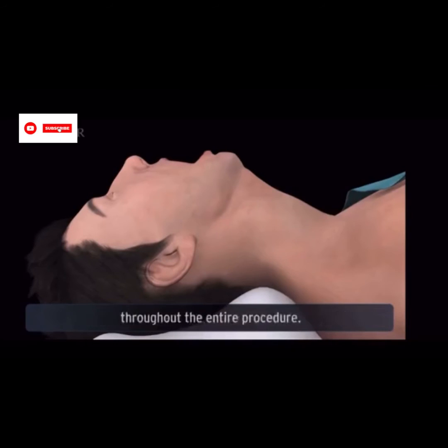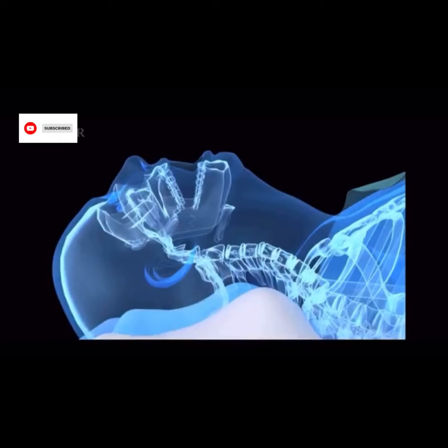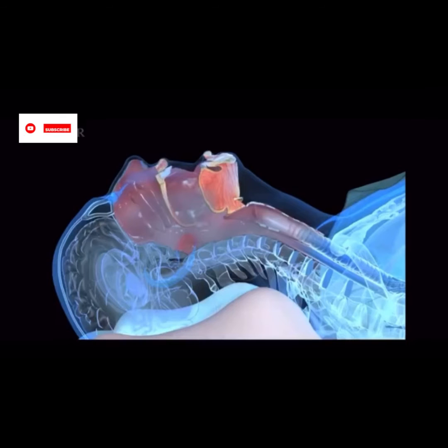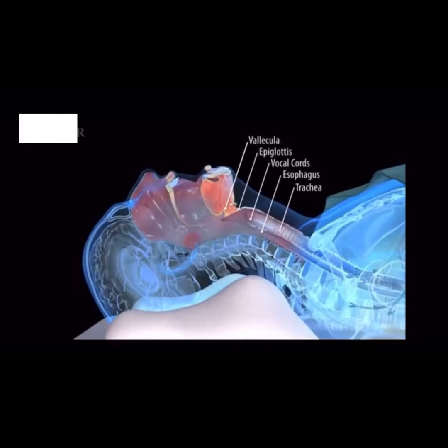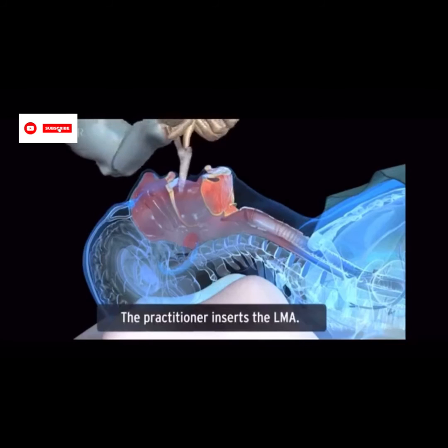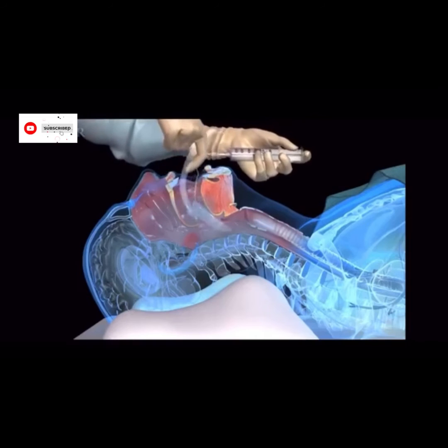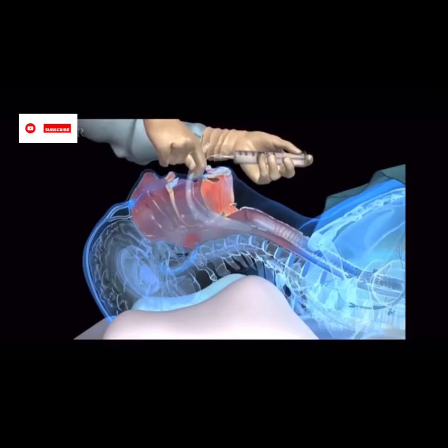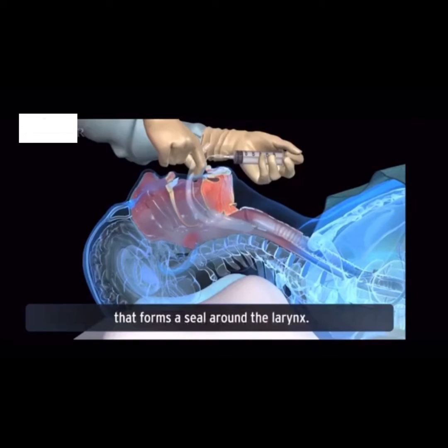With his or her head extended throughout the entire procedure, the practitioner inserts the LMA. The elliptical mask of the LMA has an inflatable collar that forms a seal around the larynx.